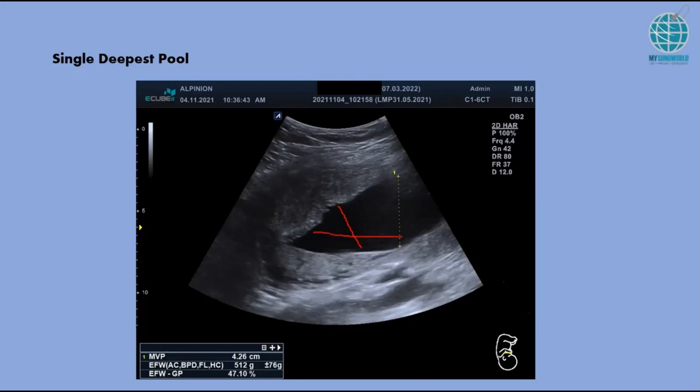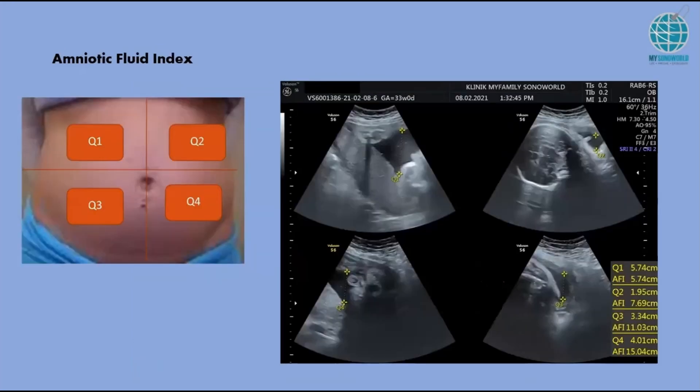Above 28 weeks, you need to do 4 quadrants. Divide the maternal abdomen into 4 quadrants — it can be either orientation, so this can be quadrant 1, 2, 3, 4 or the other way. It doesn't matter, as long as all four quadrants are different areas.